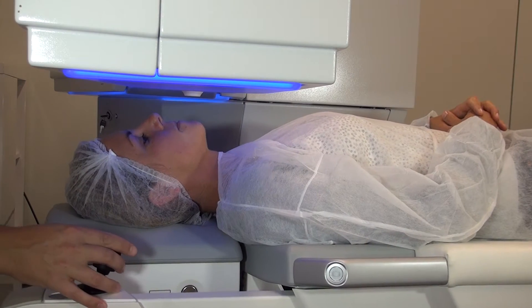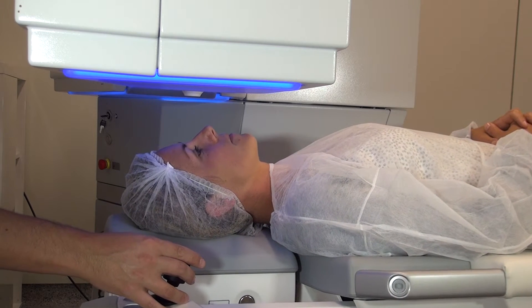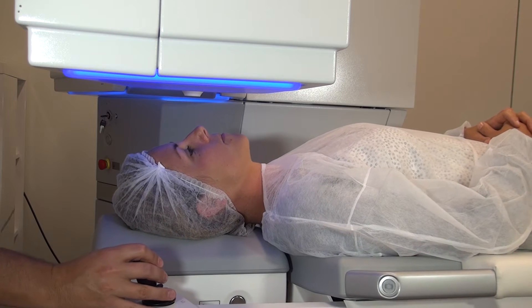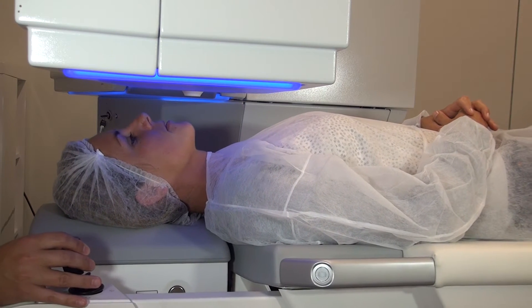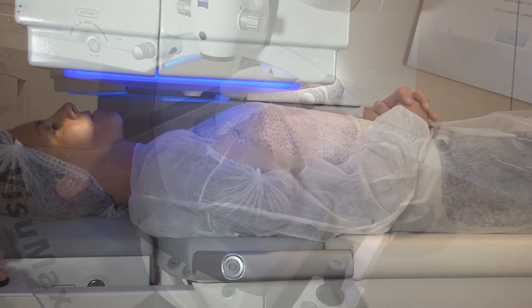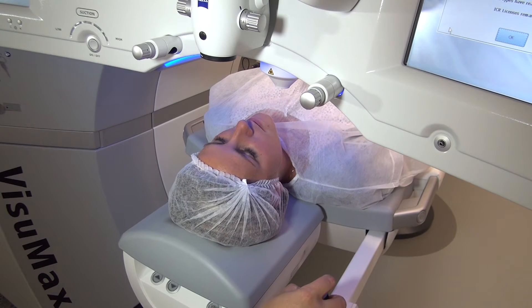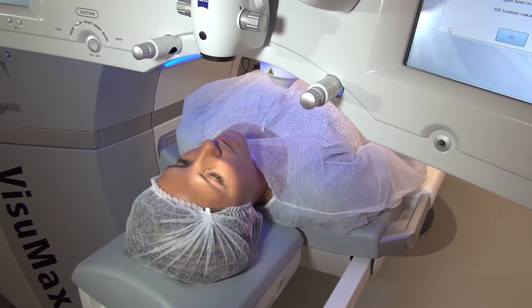So first of all, properly position your patient. When positioning the patient on the treatment bed, also called the patient supporting system, look at the position of the head from the side. Make sure the head is horizontal and look at the anatomy of the face and the orbit. Position the eye and the orbit as symmetrically as possible, making sure that the inferior and superior orbital rim are not going to intervene with the proper positioning of the treatment objective over the eye.